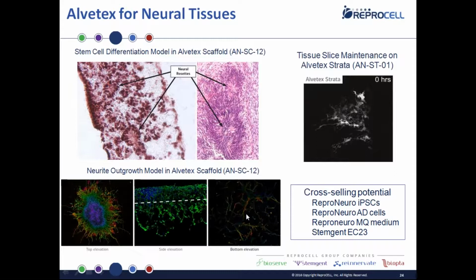And this is a very good system to look at healing of neurites or differentiation of neurites, because you have a system where you can count the number of neurites on the bottom, put your drugs on and see how that affects them. Is that going to stop them from migrating? Is that going to increase their migration? Now, the idea of migration you could also apply to a cancer model, where you would put your cells on top and look at cancer invasion inside the substrate, and you could quantify that again.